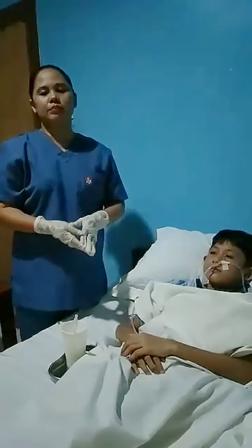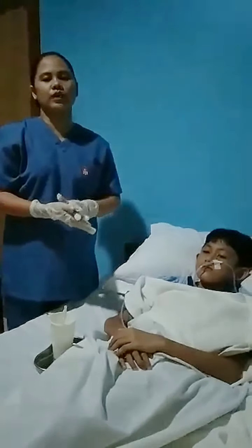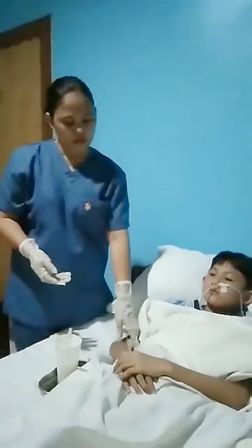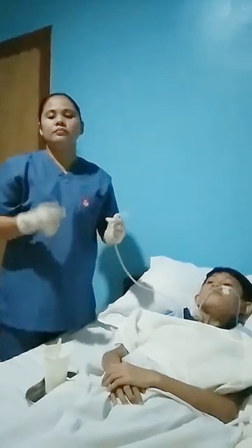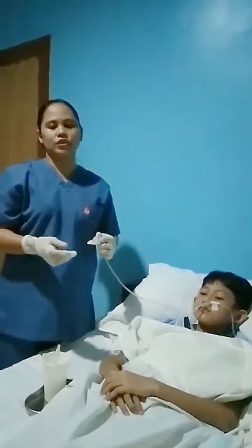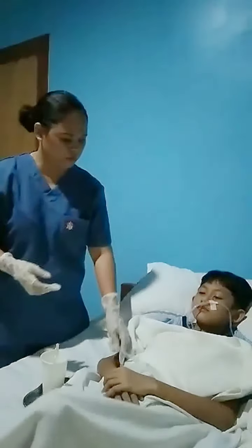Now the tube is temporarily taped, we can now verify placement. But before that, we need to make sure that the end of the lumen is kinked and closed. That is to avoid the air from going in the patient's stomach and causing distension. Check the tube in the mouth using a tongue depressor.